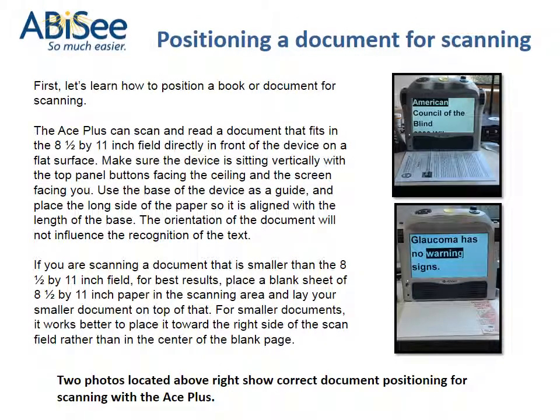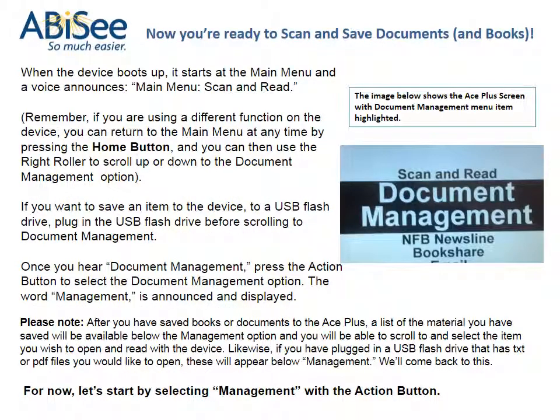Positioning a document for scanning. The Ace Plus can scan and read a document that fits in the 8½ by 11 inch field directly in front of the device on a flat surface. Make sure the device is sitting vertically with the top panel buttons facing the ceiling and the screen facing you. Use the base of the device as a guide and place the long side of the paper aligned with the length of the base. If you are scanning a document smaller than the 8½ by 11 inch field, for best results, place a blank sheet of 8½ by 11 inch paper in the scanning area and lay your smaller document on top of that, placing it toward the right side of the scan field rather than in the center.